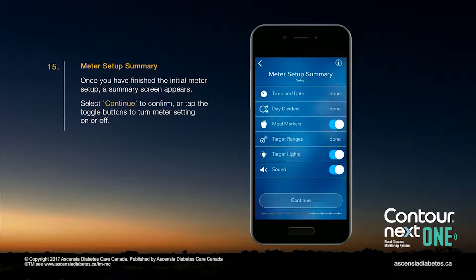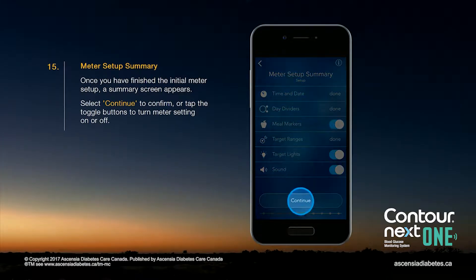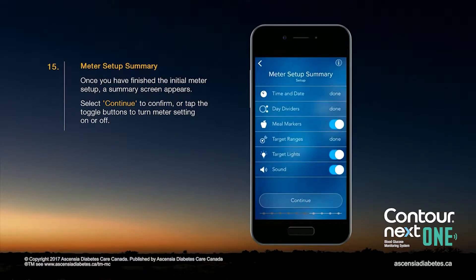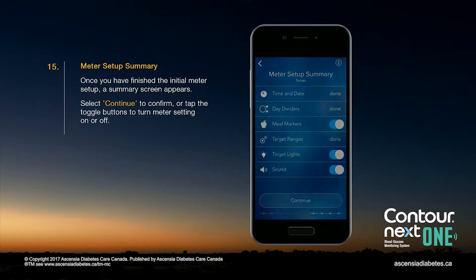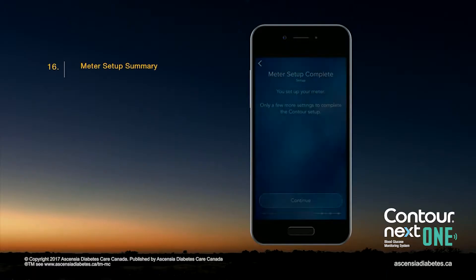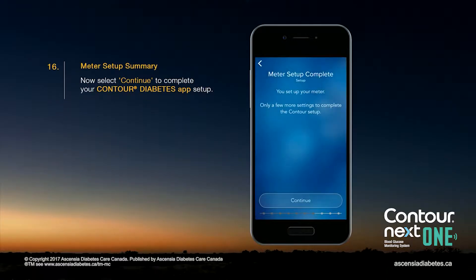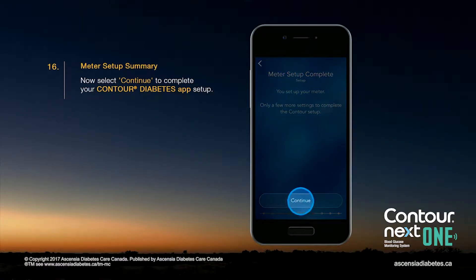Once you have finished the initial meter setup, a summary screen appears. Select Continue to confirm or tap the toggle buttons to turn meter settings on or off. Now select Continue to complete your Contour Diabetes app setup.